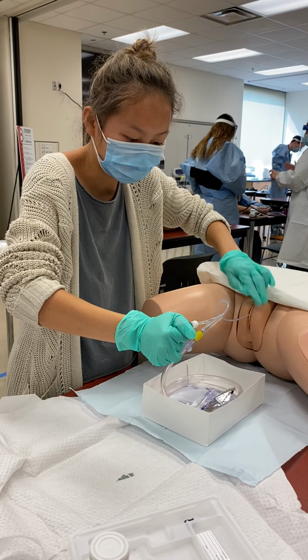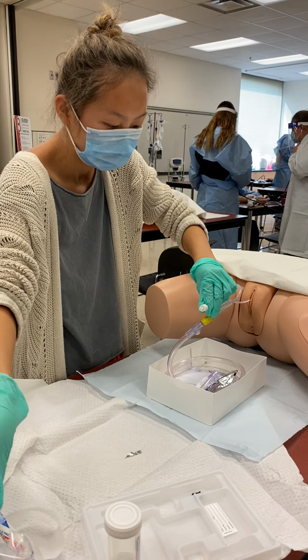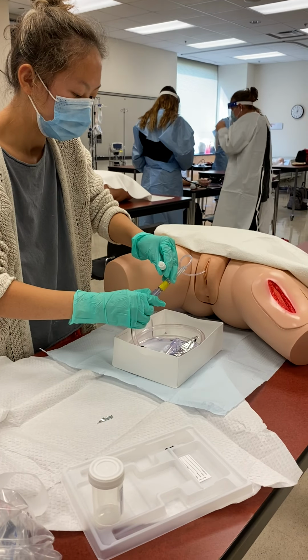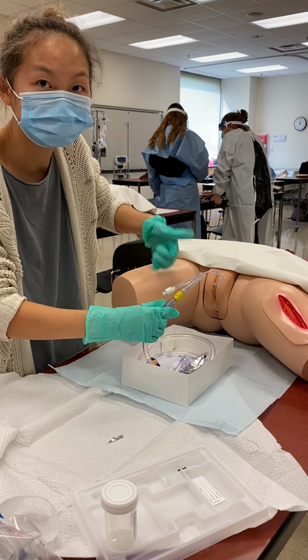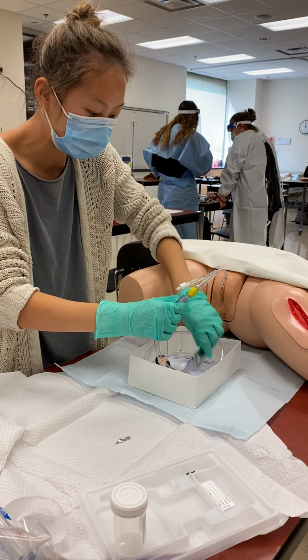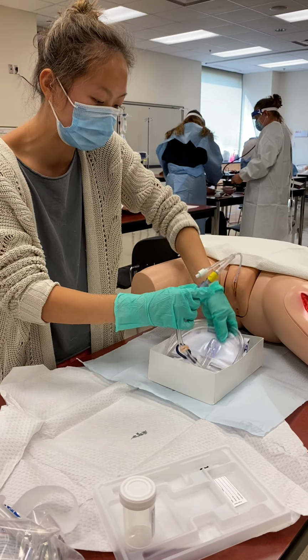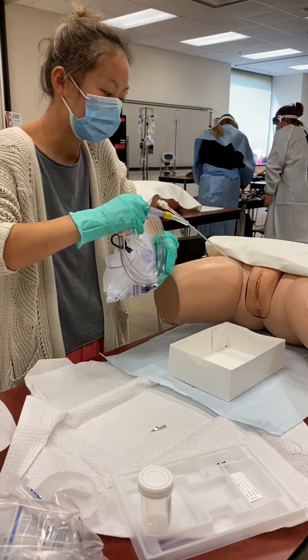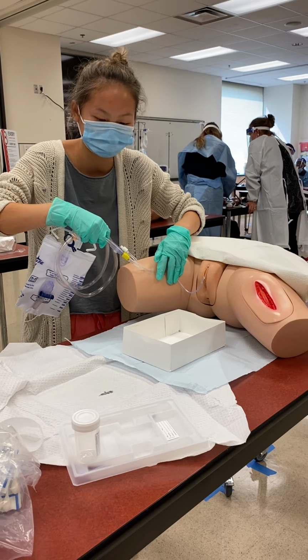And so now with my non-dominant hand, I can unscrew this and discard this over here. And we want to make sure that the balloon's inflated, so we'll pull a little bit. And since it's secure, we can take this out of the kit over here, and we would attach a leg band to the patient, making sure they have enough slack.